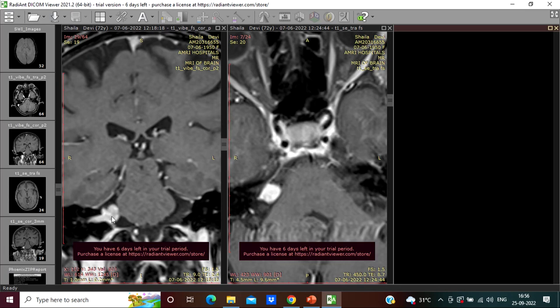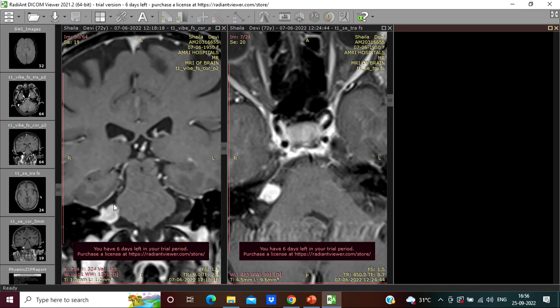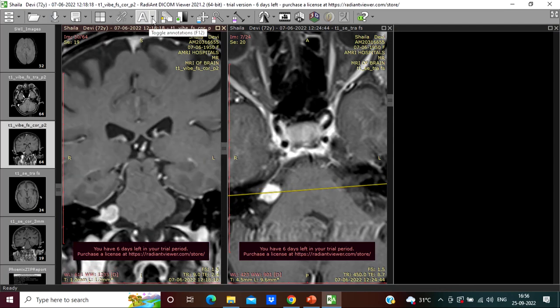Why is it the cisternal part? This black is the CSF on contrast. This is brain stem. So this tumor is not compressing the brain stem. It is just reaching up to the level of the brain stem. Can you see? Yes. It's not compressing at all on the brain stem. And this cisternal component is the most important one, the complex one which we need to remove. The idea is to preserve the facial nerve. The most important is facial nerve. See, this cisternal component is more than a centimeter.